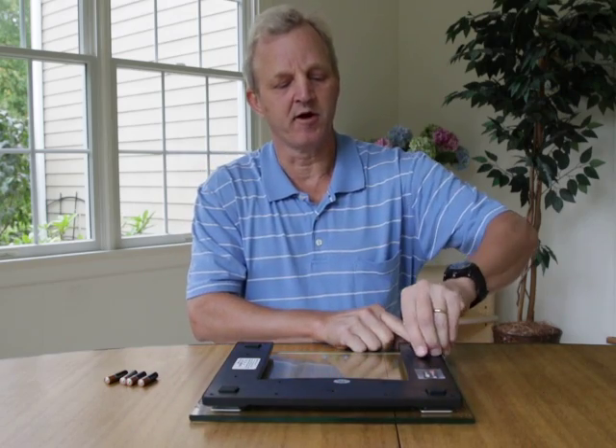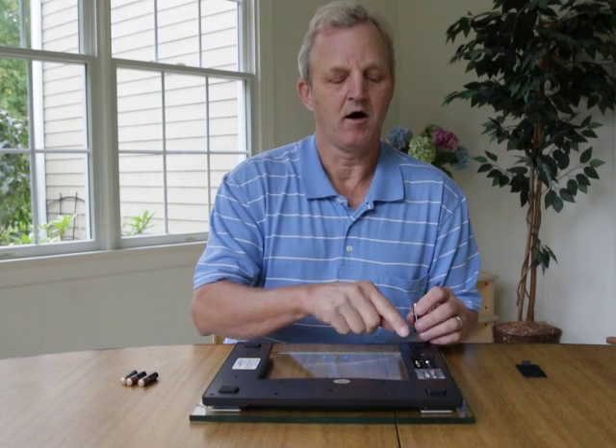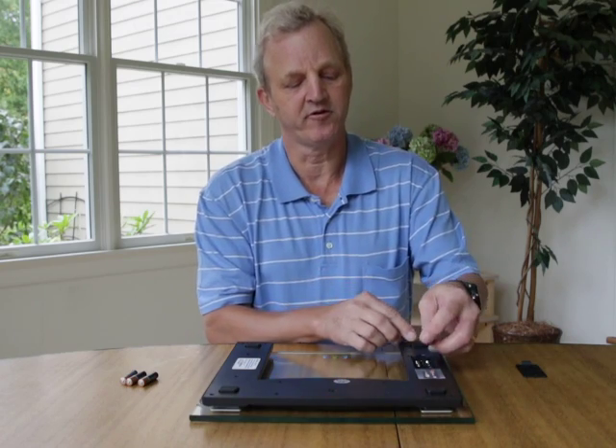You open the battery compartment, and then on the right side of the battery compartment where the spring is, you put the flat side of the battery against the spring.